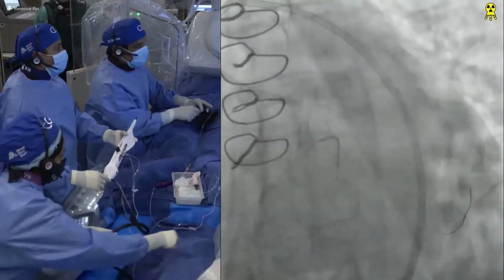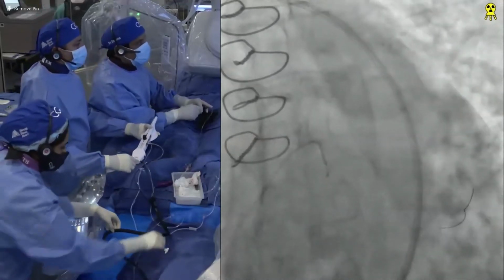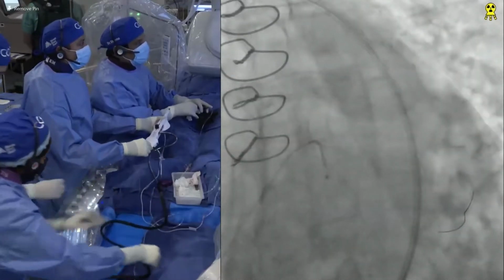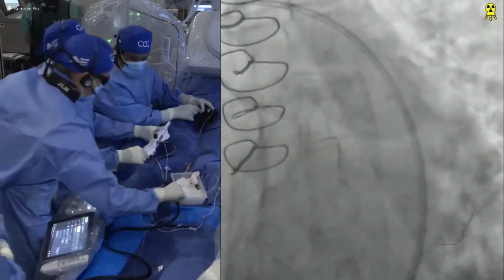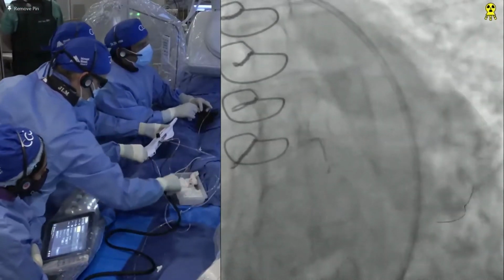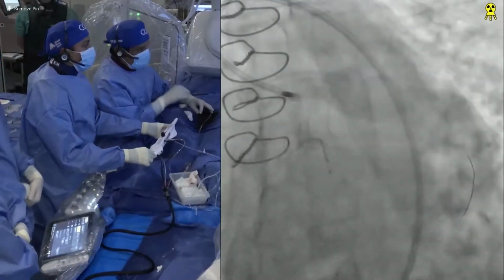Now, the biggest question here will be that the burr can get stuck in this unexpanded stent. Very common. So we have to be very, very careful. If we cannot even go completely, which is okay, people ask, are you going to ablate the stent? You have to pull a little harder. No? Okay. We have the 2.15, you know the guide. Yeah, good. So we are okay.